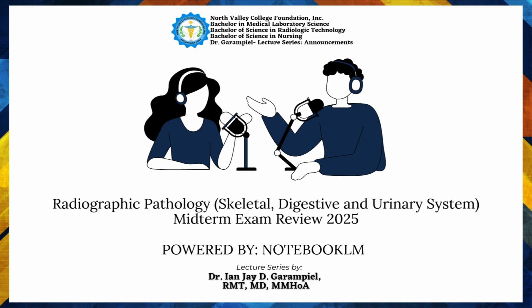Then we have the visually dramatic ankylosing spondylitis, which gives us that famous bamboo spine. That diagnosis is often confirmed in patients who come in with chronic lower back pain and stiffness. The key radiographic feature is the bilateral and, crucially, symmetric involvement of the sacroiliac joints. It progresses up the spine, eventually leading to the fusion of the vertebrae, giving that bamboo-like appearance.